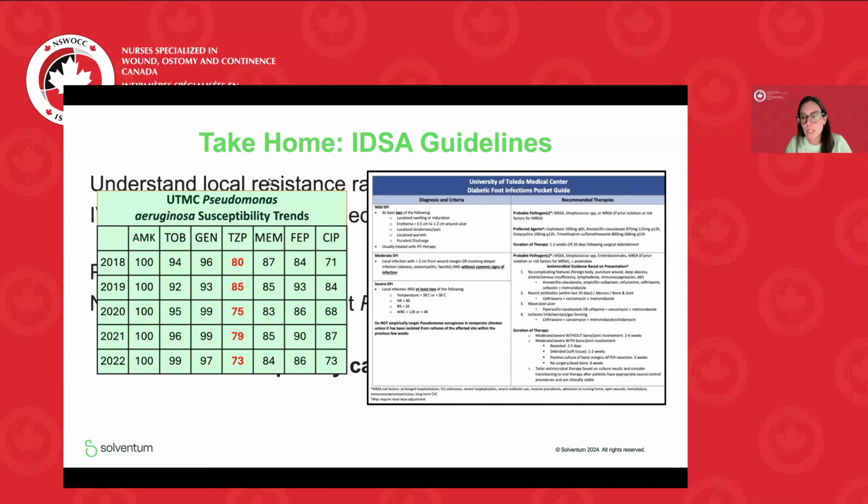And then he underwent an angiogram and had an angioplasty. There you can see the right anterior tibial artery, peroneal artery, and posterior tibial artery, as well as a drug-coated balloon angioplasty of the right SFA. So he had pretty significant disease that we were able to optimize.